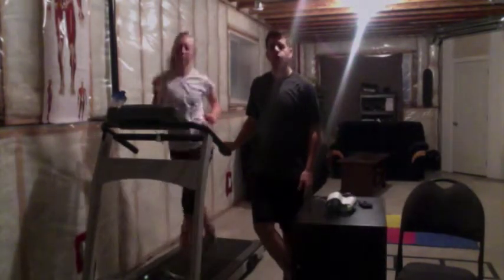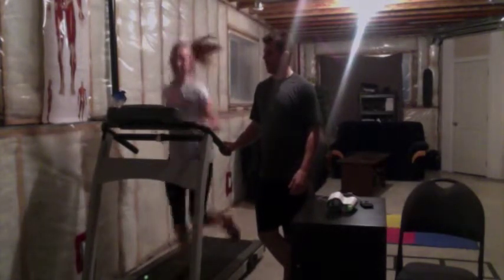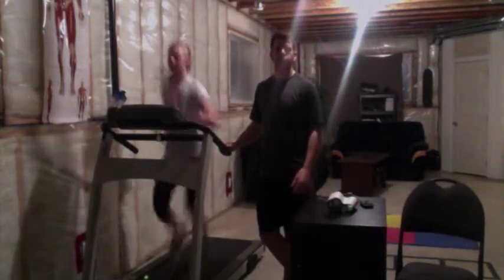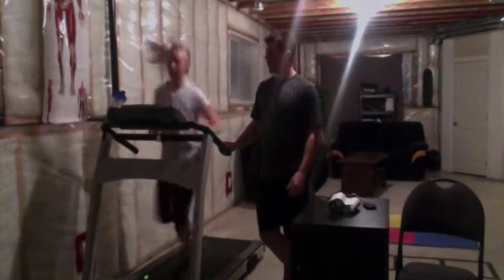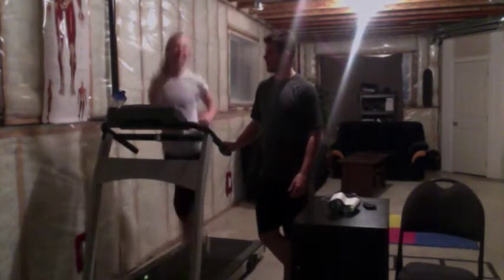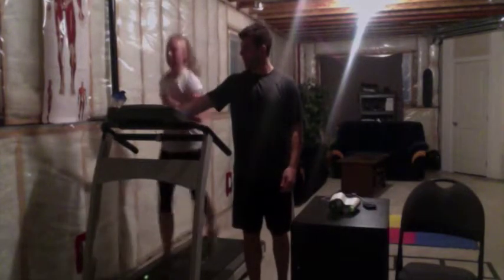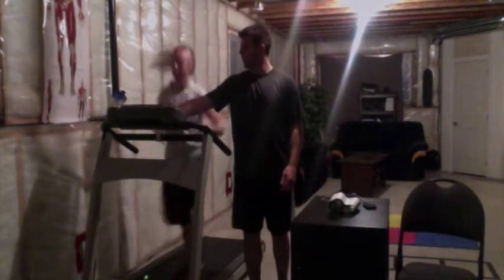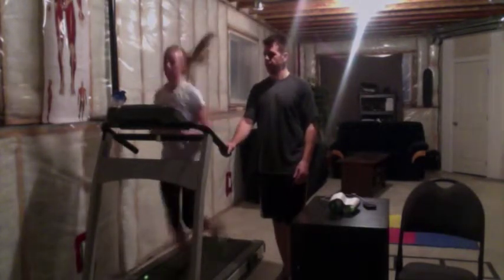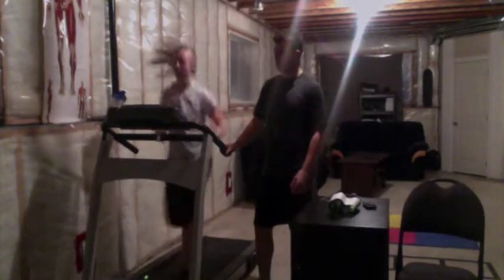Okay, so here we are. We're 3 minutes into above the anaerobic threshold level, and Kaylee's sitting at 175 beats per minute, so we're about 6% above her AT. How are you feeling on the RPE scale, Kaylee? 15. 15? Right on. Okay, so that's 3 minutes. We're gonna bump her back down to 5.5 miles per hour, and that'll bring us to 10% below your AT heart rate. So we're looking for 155 BPM.